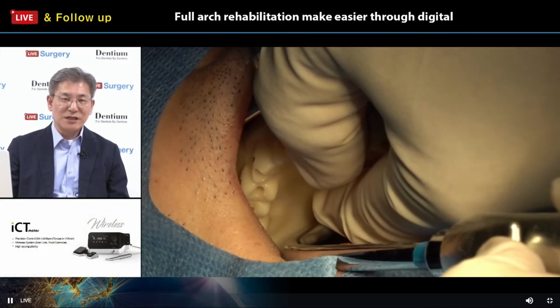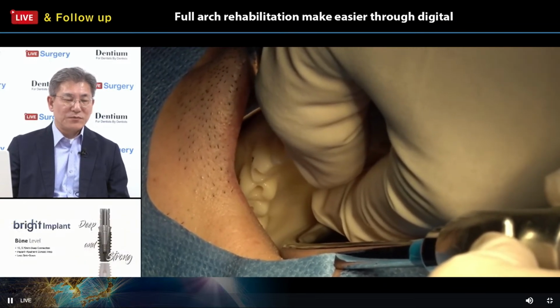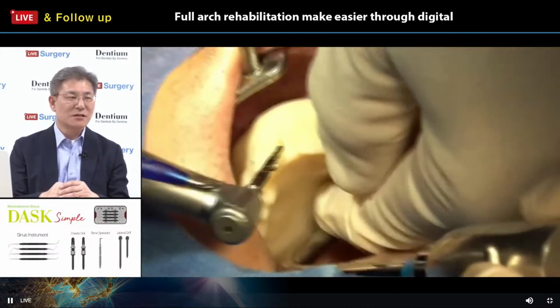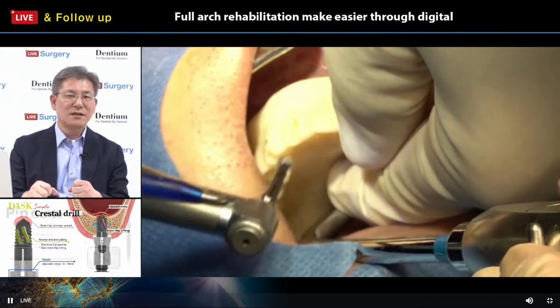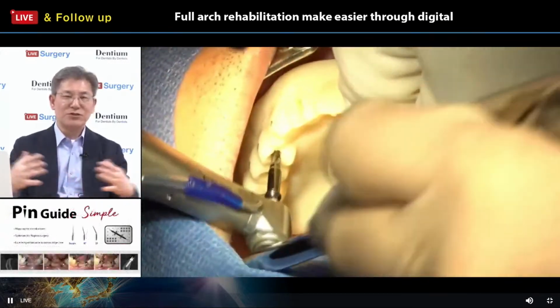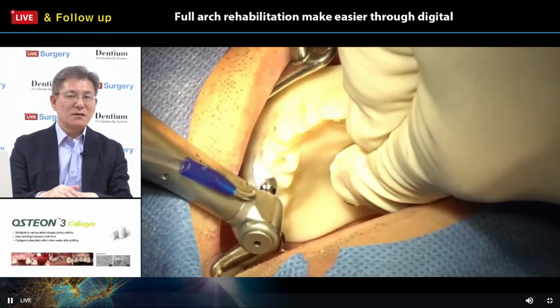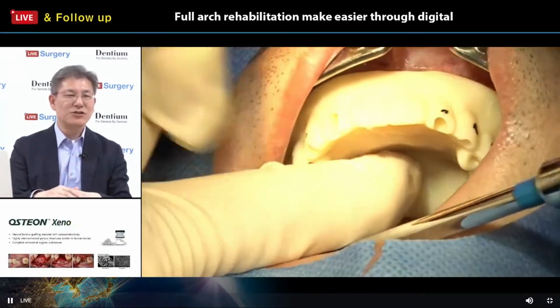As I mentioned earlier, how can you achieve this kind of printed denture? The files are matched with each other on the software program, from the CT STL and the intraoral scan STL, and the actual patient soft tissue holds this reference point, using the reference plane for matching the information.